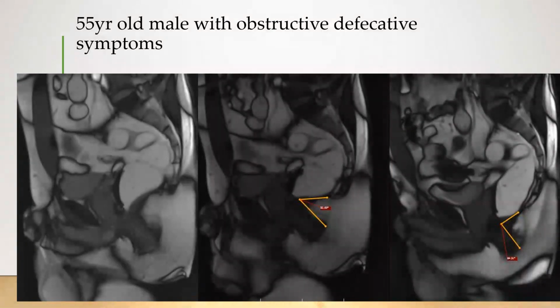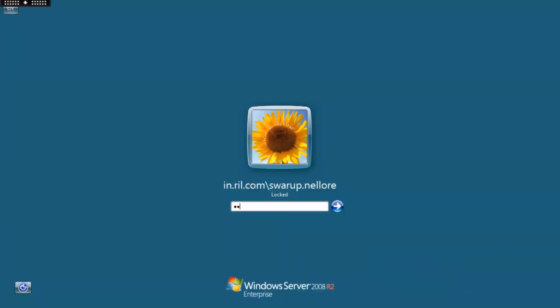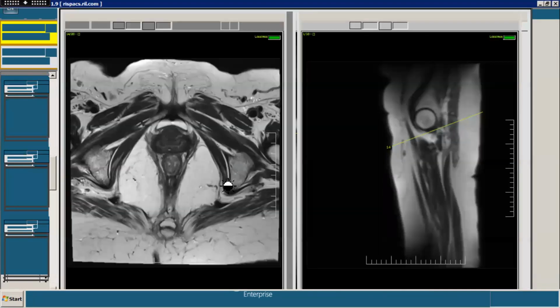Also, for the structural images, show one axial T2-weighted image, if you have any case, which shows the structural anatomy at the level of the introitus. I want to basically show the bladder, the vagina, and the rectum in a patient with grade 3 prolapse.